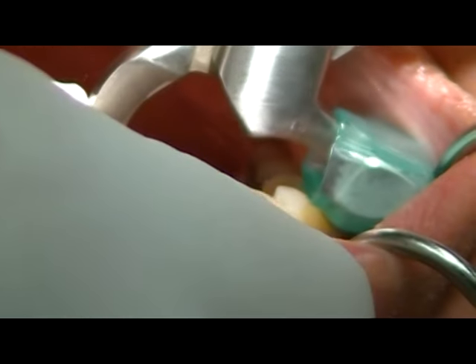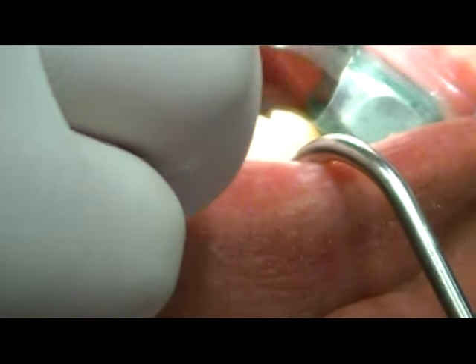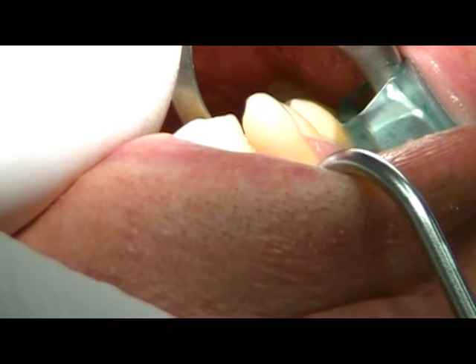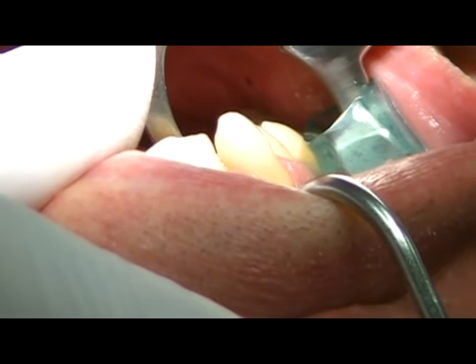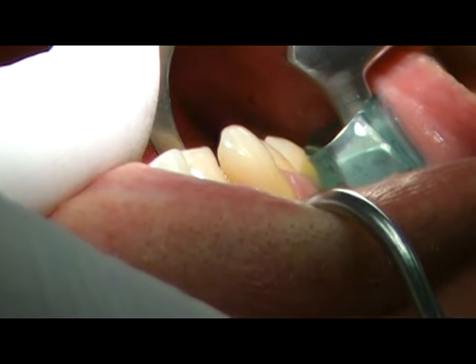Now for demonstration here, we are trying to engage the lingual surface of the tooth as much as possible with the beak, and the bumper on the facial surface. I am using my left hand here for demonstration and I am just rotating my wrist ever so slightly.